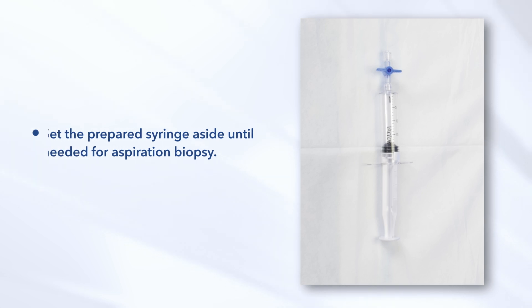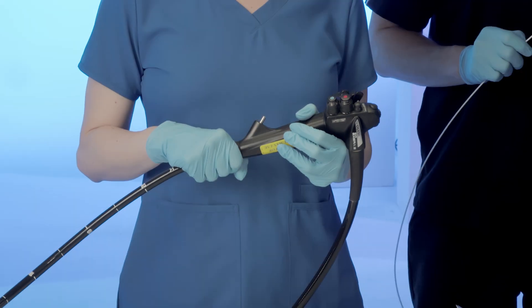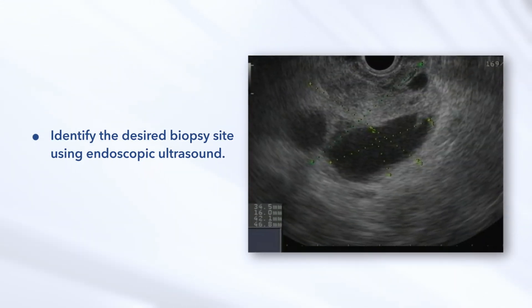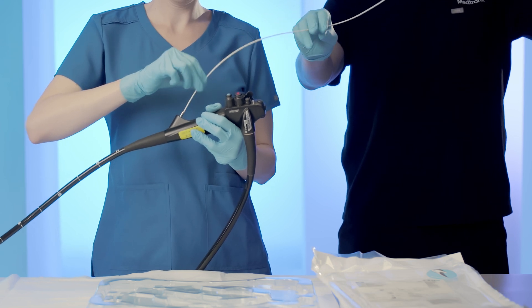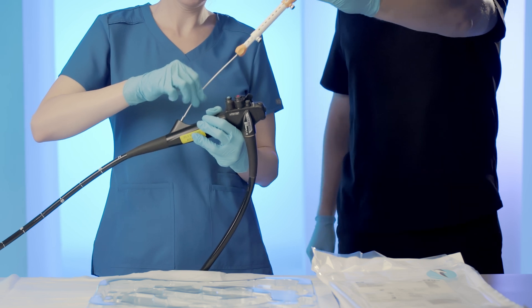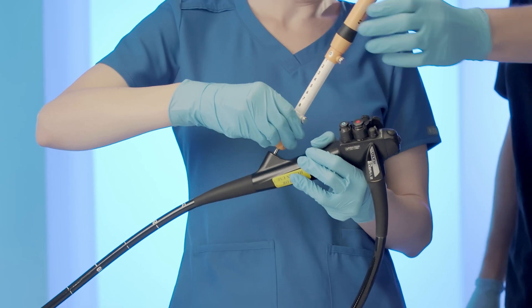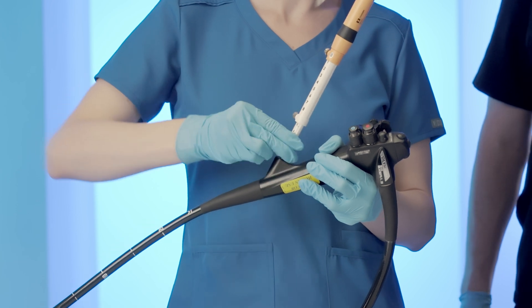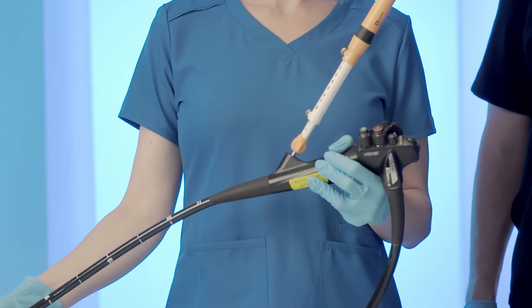This action will create a vacuum in the syringe. Set the prepared syringe aside until needed for aspiration biopsy. Insert the device into the endoscope. Identify the desired biopsy site using endoscopic ultrasound. Insert the device into the ultrasound endoscope in short increments until the luer lock fitting at the base of the sliding sheath adjuster meets the fitting on the instrument channel. Attach the device to the instrument channel port of the endoscope by rotating the device handle until the fittings are securely connected.